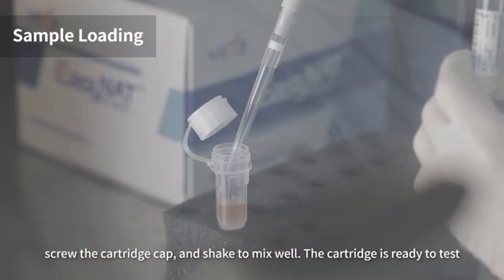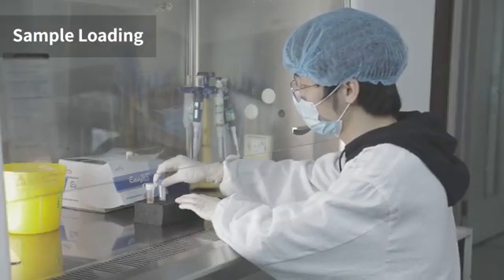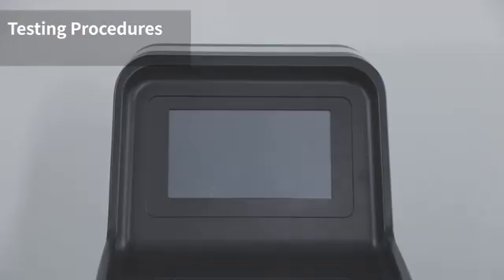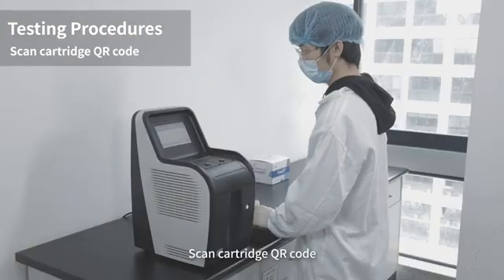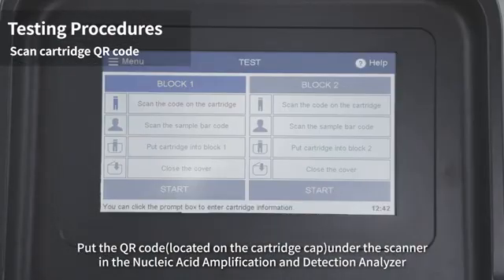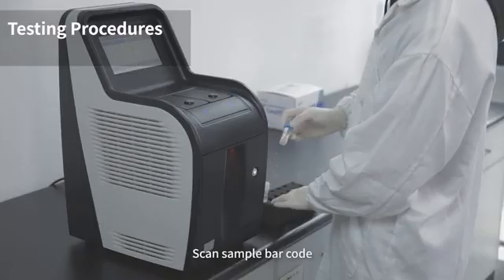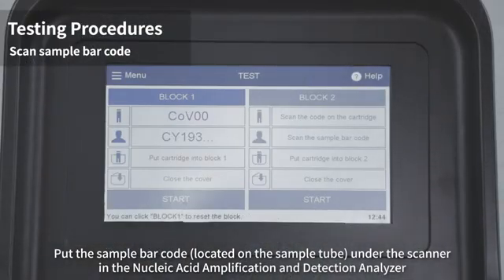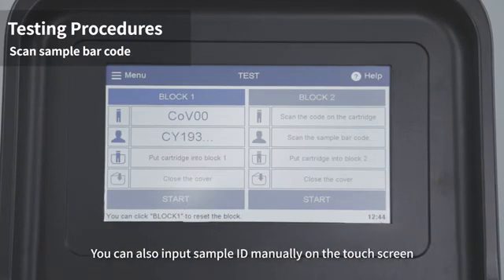Once the cartridges are ready to test, proceed to testing procedures. Scan the cartridge QR code by placing it under the scanner in the nucleic acid amplification and detection analyzer. The analyzer will automatically read the cartridge sample ID, or you can input the sample ID manually on the touch screen.